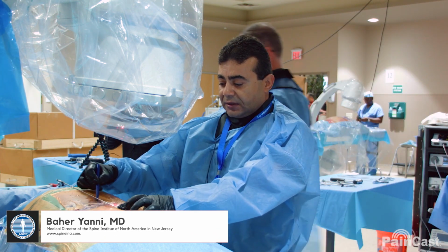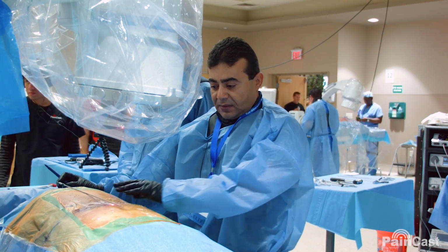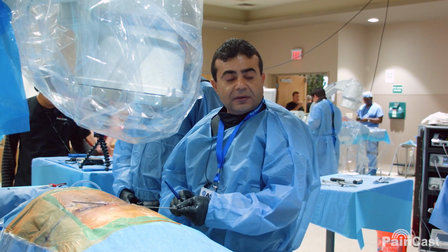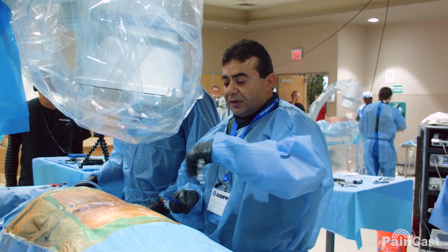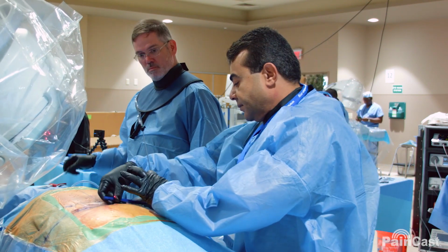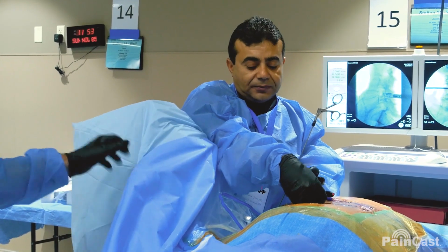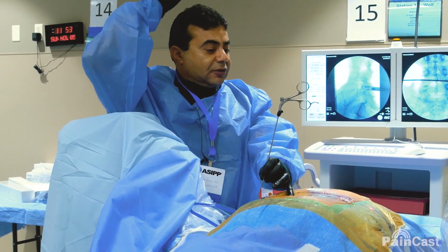This is our AP. You want to mark it in the patient. That's the midline. And then you want to mark the L4, L5 disc. Here you mark it. And then you go on lateral view, and you want to mark how laterally you're going to go. The way we measure it is we want to measure our trajectory.